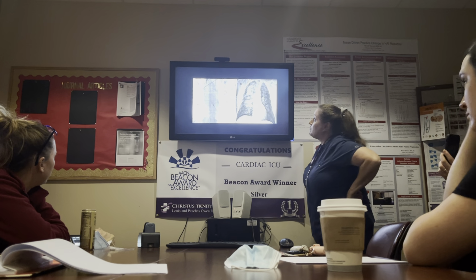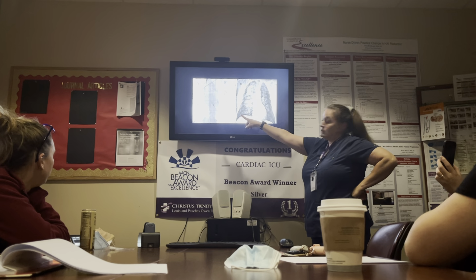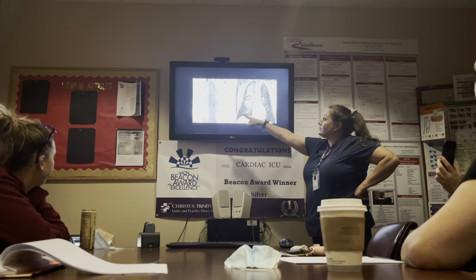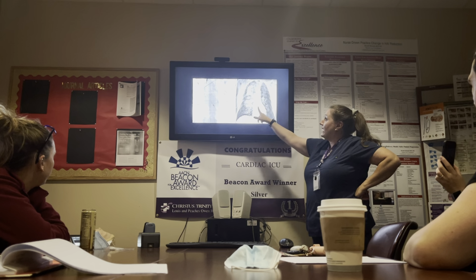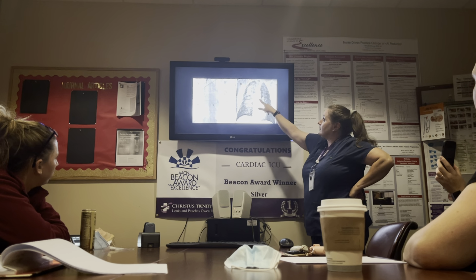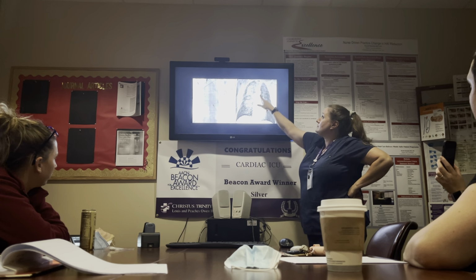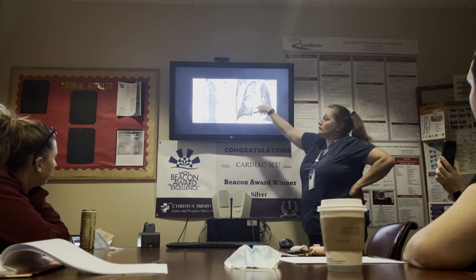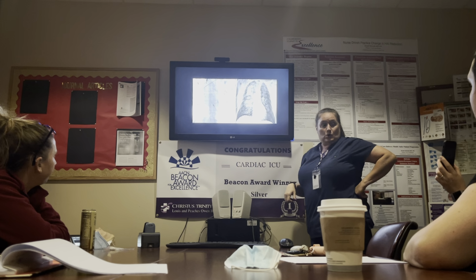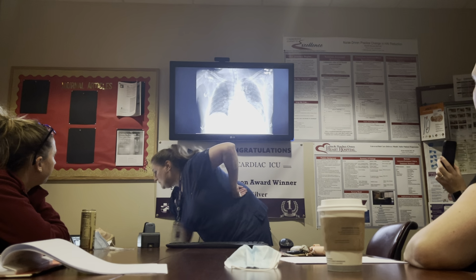And this is a little bit more of a, what? This is an Impella device being placed. That's the fluoroscopic view of that. And then you've got actually a femoral Swan coming in, and that's why I liked this picture, is you've got a femoral Swan in, but you've also got the Impella device sitting right there, going across the aorta, okay? Okay.